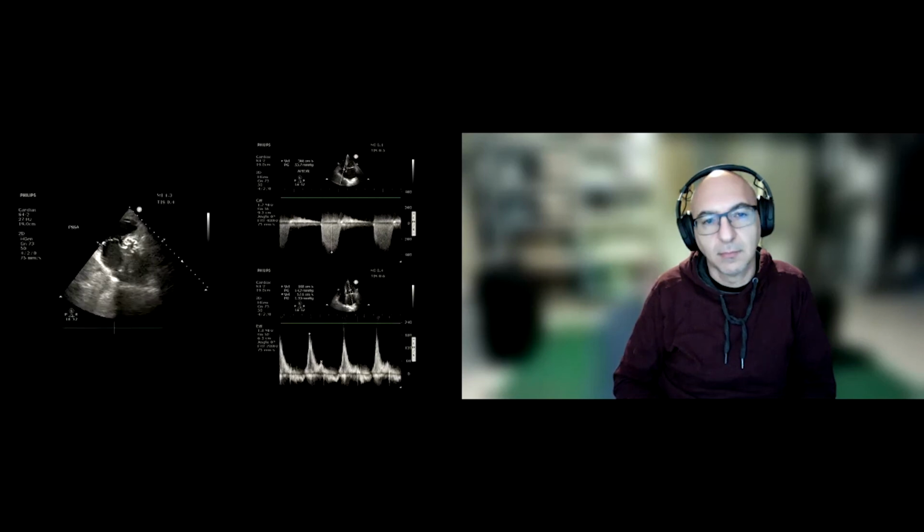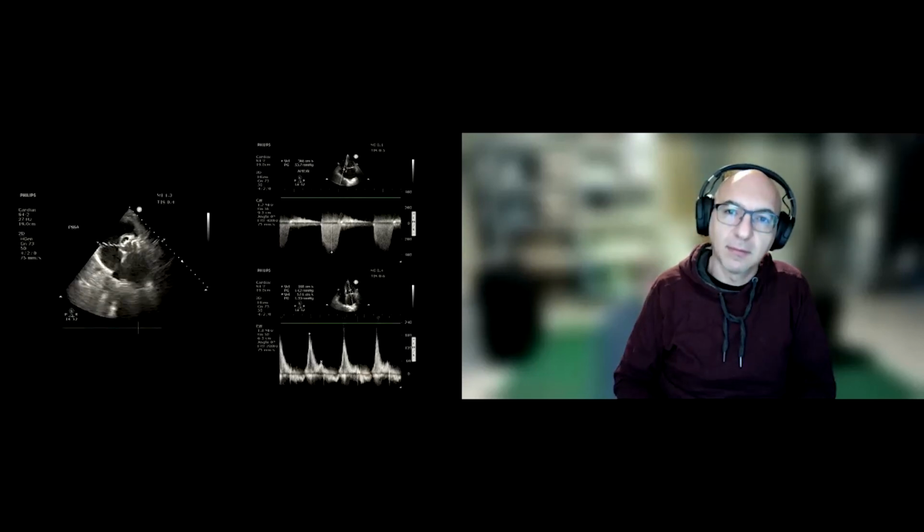And so I think we have a good understanding as to why the patient's dyspneic and what we're going to do about it. We've talked about that, but I want to throw two curveballs at you, Z, and just see where you want to go with this one. This is the way I like to think: we have a pretty standard thing. Wow, I made it through that one, and I was able to help the patient out. Now, as I'm driving home, what if I change parameter X or Y? How would that affect my management?